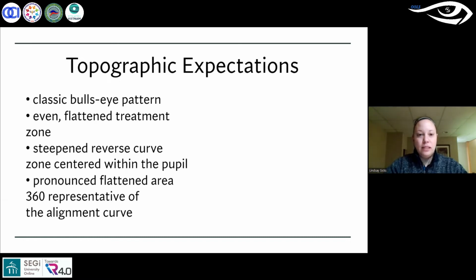We have axial map, tangential map, or difference map. Awesome, great. So I have launched and a couple of them have already started to vote. I'm just gonna leave this on for the next 10 more seconds and share the results. Kind of a tough fight between some of the options here. Yeah. Right, but yeah, I'm gonna end this and share.